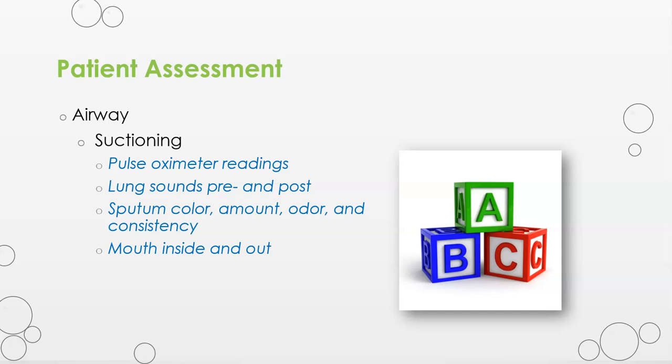As you have learned in the skills lab, suctioning should not last longer than 15 seconds. The lowest possible suction setting should be used to prevent trauma to tissues, usually no more than 100 millimeters of mercury. What is the appearance of the sputum and all of the characteristics that could indicate an infection? What were the lung sounds before suctioning and what were they after suctioning? After suctioning, also reassess all of the vital signs and lung sounds.